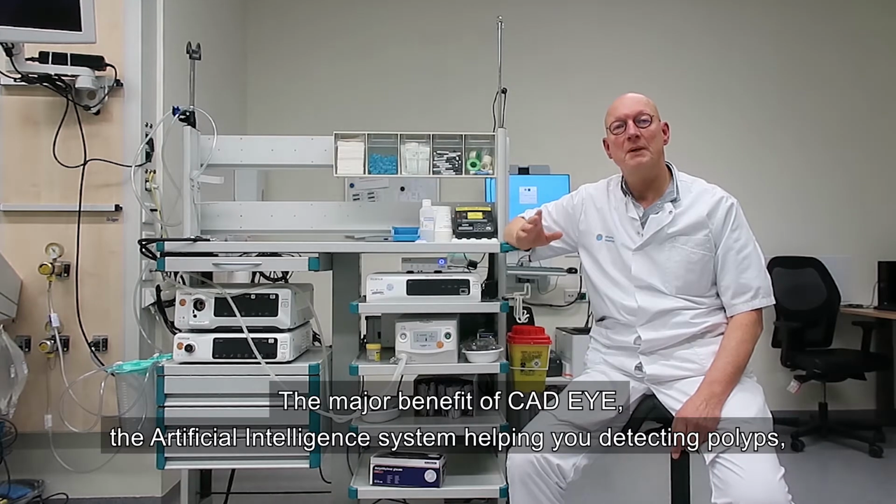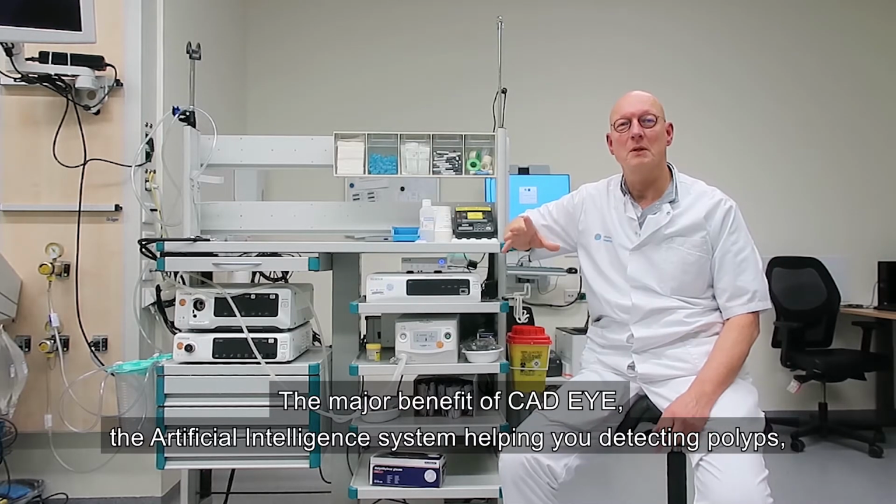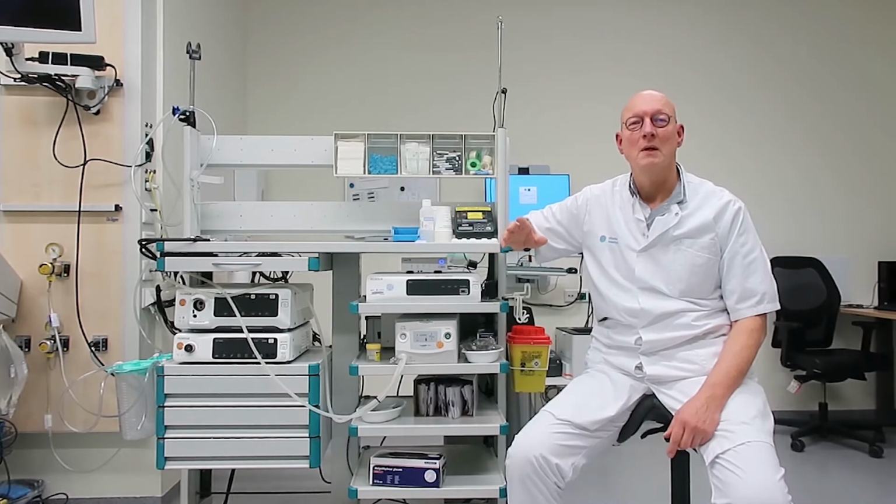Well, the major benefit of CAD EYE, the artificial intelligence system helping you detect polyps, is that the ADR is going sky high for any endoscopist adequately working with this system.